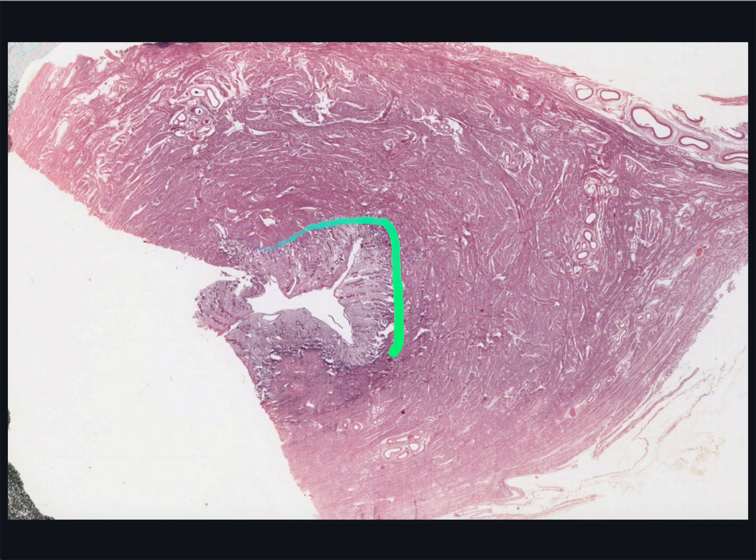The perimetrium is a little bit scrappy and it's on the outside. The myometrium is composed of bundles of smooth muscle cells separated by seams of connective tissue. Even at this low magnification, you can see small profiles of many uterine arteries that run in the middle part of this muscle layer.